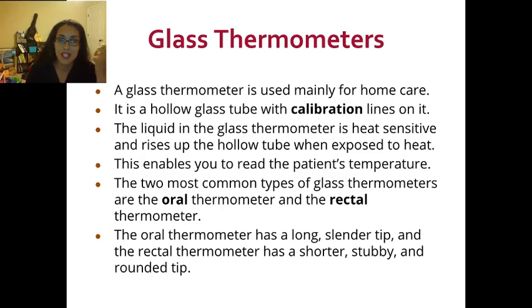That's not safe, and considering we have new technology, that's not even worth the time. But it's a hollow glass tube with calibration lines on it. The liquid in the glass is heat sensitive. It used to be mercury. Mercury is very heat sensitive.